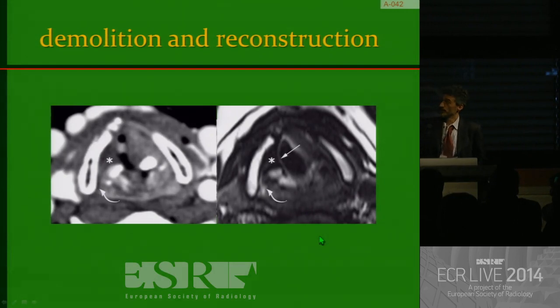When you deal with a patient that has been treated with laser excision, normally the skeleton of the larynx is not involved. So what you find is a lot of scar tissue due to coagulative necrosis induced by the laser. What you see normally in a normal postoperative scan is retraction in the site of the surgery, which is much better displayed by MRI rather than CT.